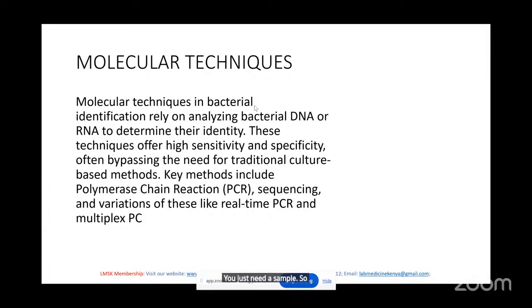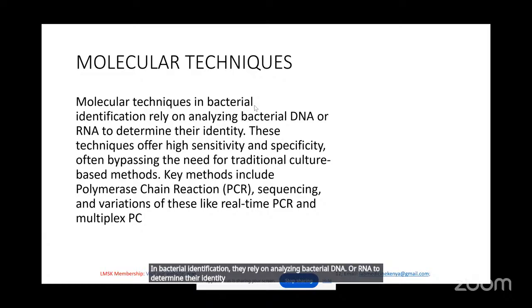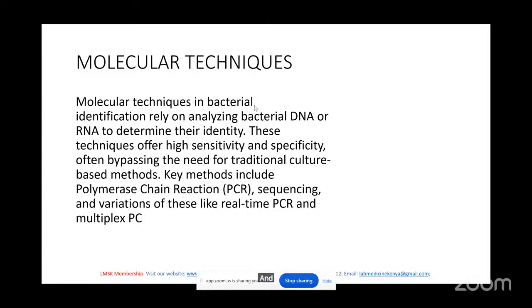So molecular techniques in bacterial identification rely on analyzing bacterial DNA or RNA to determine their identity. These techniques offer high sensitivity and specificity, often bypassing the need for traditional culture-based methods. So I'll mention the key methods like PCR, real-time PCR, and multiplex PCR.